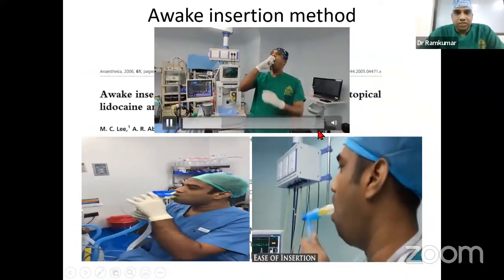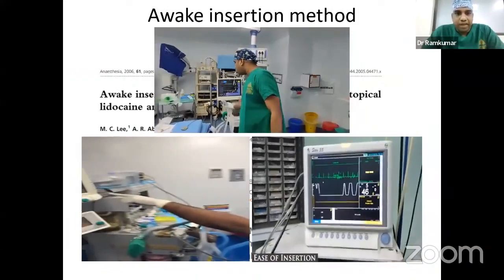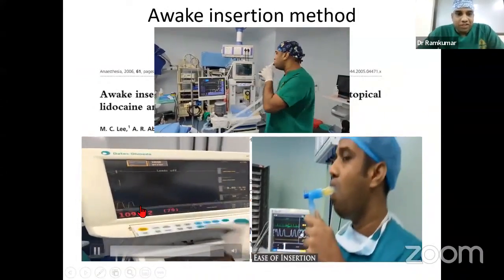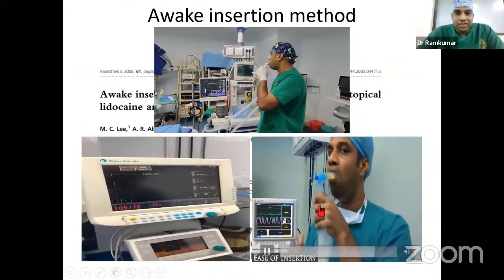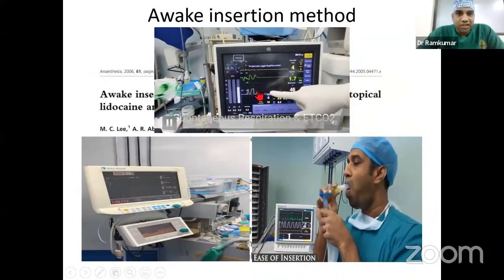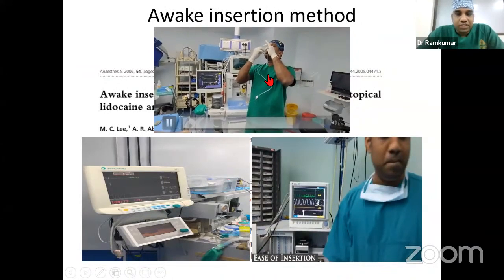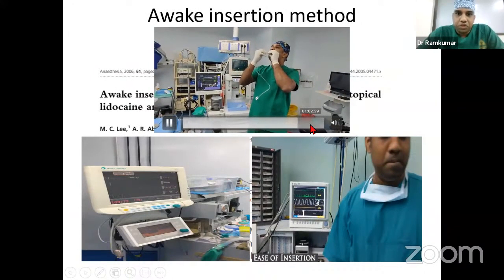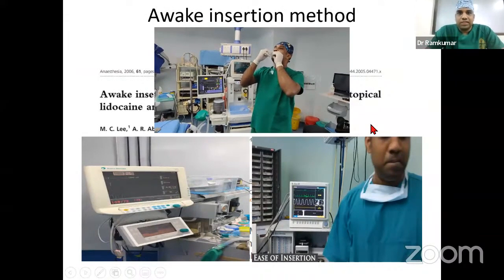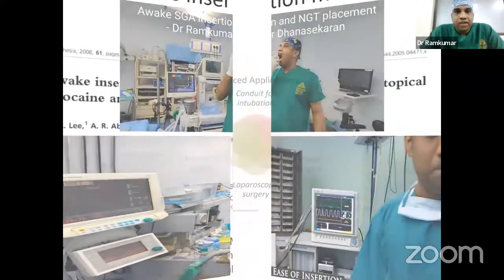With the insertion technique, there's no need to insert your finger; keep your fingers distal, and just pass along the palate. In all 3 devices, I could get very good ventilation. I mean, very good spontaneous ventilation. So I thought instead of trying on a patient, I'd do an awake insertion on myself, and I was able to pass it, and we get very good spontaneous ventilation through it. And with this device, I'm able to pass a nasogastric tube also. That doesn't mean that you have to try this always. This can be helpful if you don't have anything else, if the patient has a difficult airway.